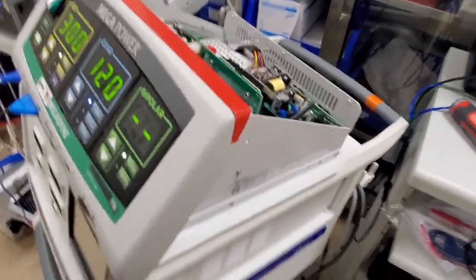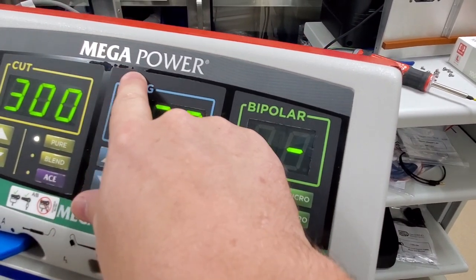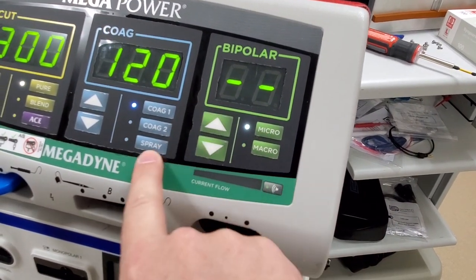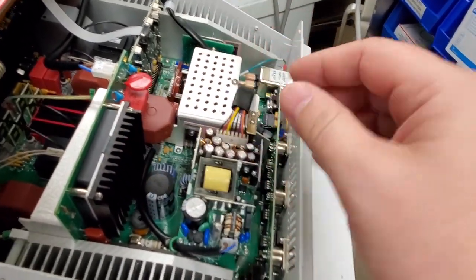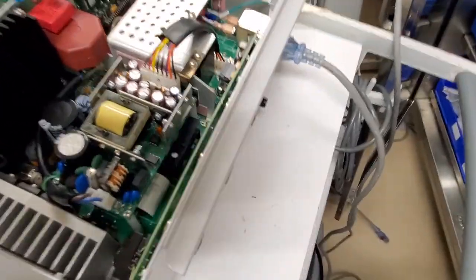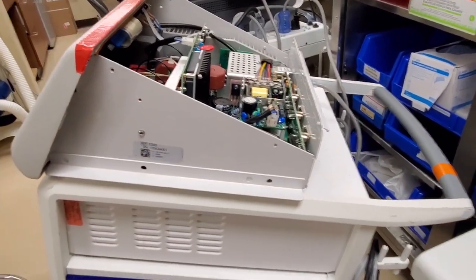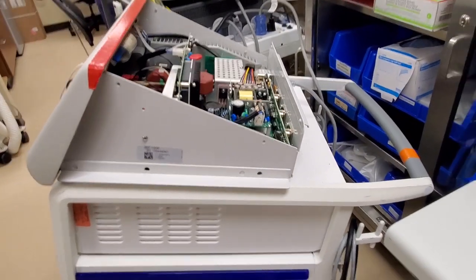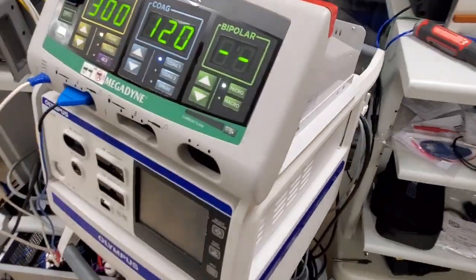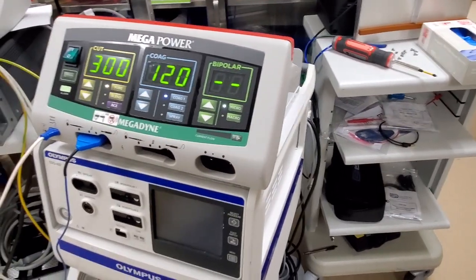So I'm not a fan of the Megadyne as it is. Only a couple months old — take a look at the peel I already got on the screen, look at all this. It's got internal cooling fans, which is already better than the Force Triad that I talked about in another video. However, those fans still got to get cleaned. And of course the profile of this guy — it's fatter than a standard ESU. You can see it doesn't even really fit on this Olympus cart, and it's curved, so you can't stack anything on top of it, which makes it a real pain in the butt to try and put on a boom, because everybody likes stacking stuff on top of ESUs.